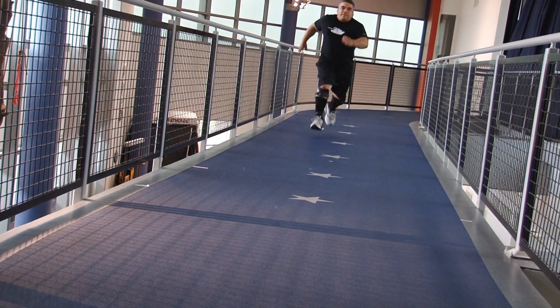Three days after I had my IDEOs, I was able to sprint. The first time my wife saw me run, she had tears coming down. My IDEOs have brought new life into the whole family. Now I actually look forward to every day.